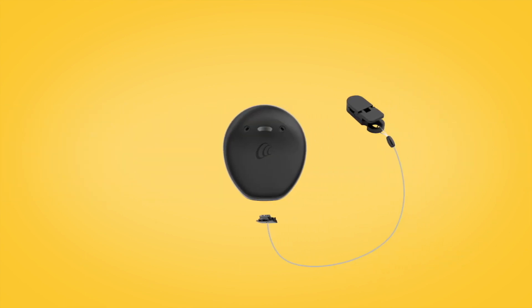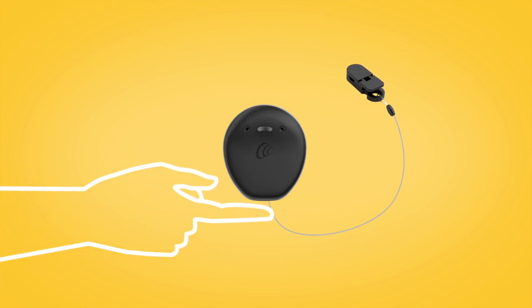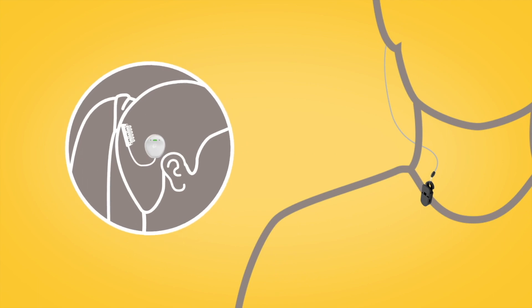To attach a safety line, put the safety line connector in the socket of your sound processor and press until it clicks into place. Then use the safety line clip or hair clip to attach your sound processor to clothing or hair.